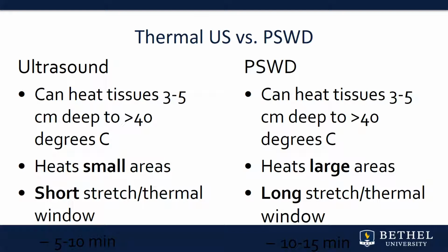I just want to make a note, too, that in your book, I think there's a table, it's 15.2, that has the recommended parameters for diathermy. You don't need to memorize these, but just know that it's a good reference if you would ever need to set this up and you don't have the operator's manual.